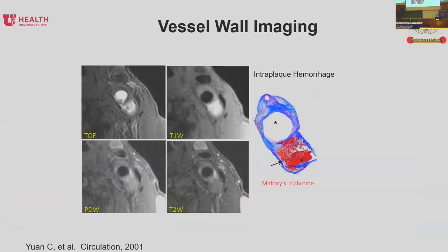Yeah, I'd like to focus today on this so-called vessel image analysis. But a little background on this is a publication we had in 2001. And that's sort of a starting point of looking at this vessel imaging. And this is a picture of carotid artery and using this so-called multi-contrast weighted images and looking at both the lumen of the carotids and also the plaque itself. And this is the beginning point of trying to stay away from simply looking at stenosis.